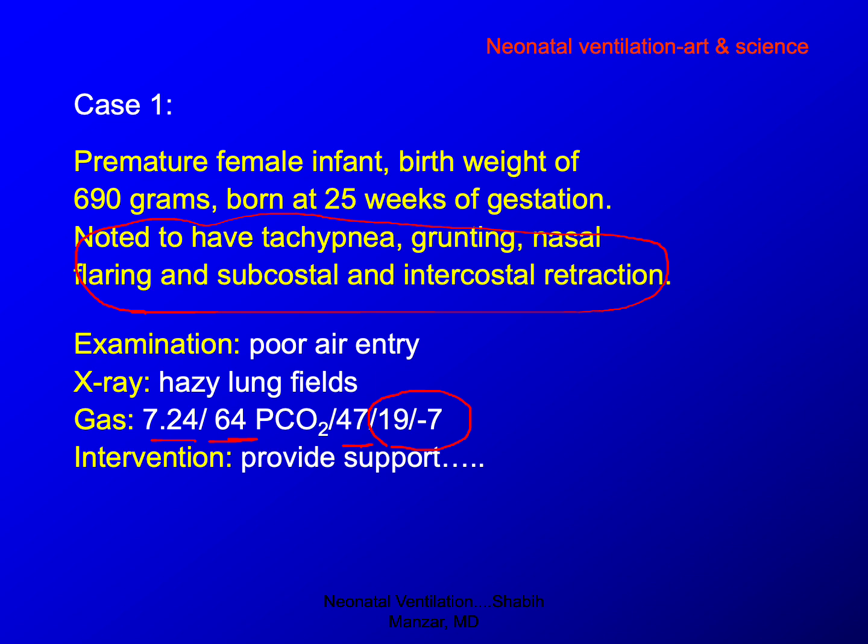Intervention: we all agree that now we have to support. So what do you want to do? Do you want to start nasal cannula? Do you want to do CPAP? What do you guys think? Think about it. Yes or no?